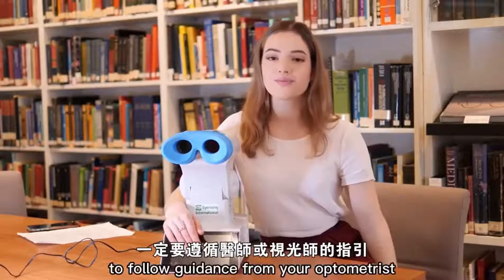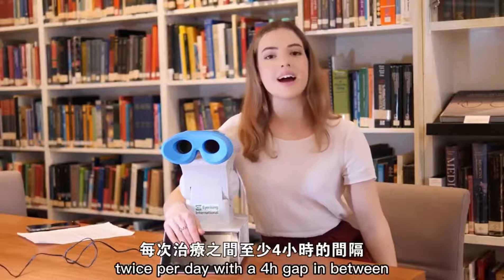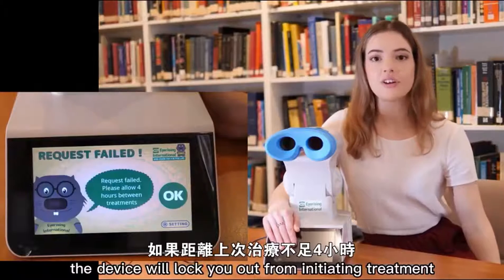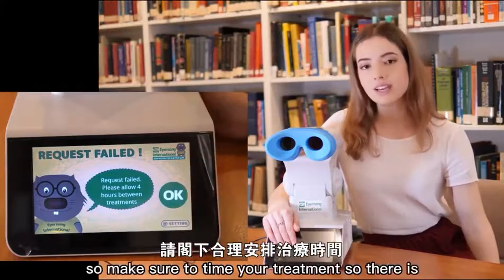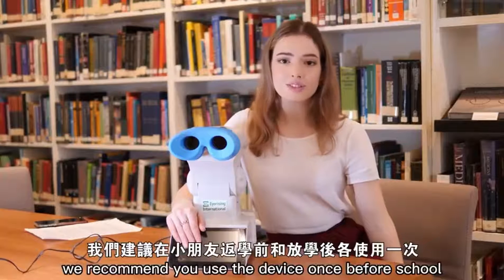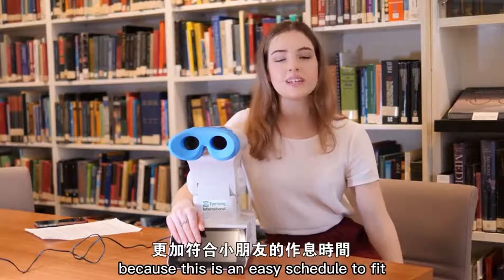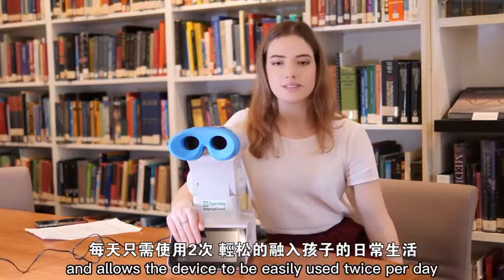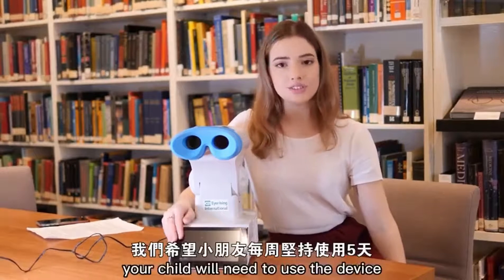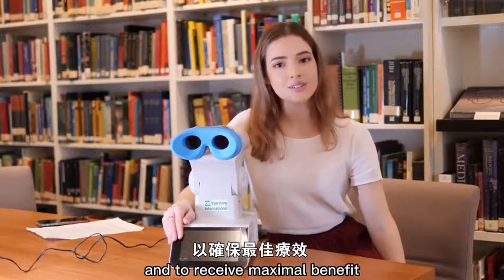It is important to follow guidance from your optometrist and use the device twice per day with a four hour gap in between as per trial instructions. The device will lock you out from initiating treatment within four hours of the last session, so make sure to time your treatment so there is enough time in the day to fit both. We recommend you use the device once before school and once after school, as this is an easy schedule to fit into your child's routine. Your child will need to use the device five days per week in order to comply with the trial instructions and to receive maximum benefit.